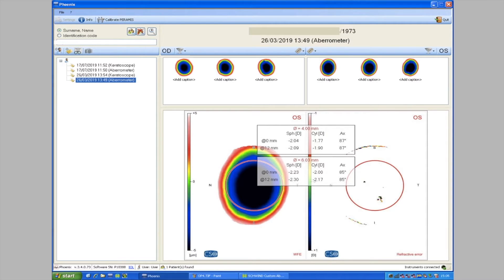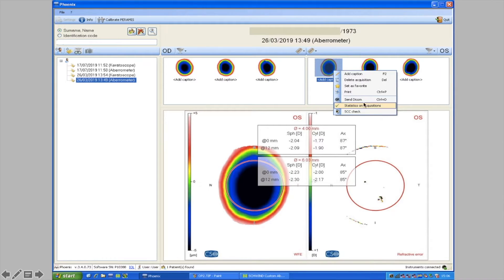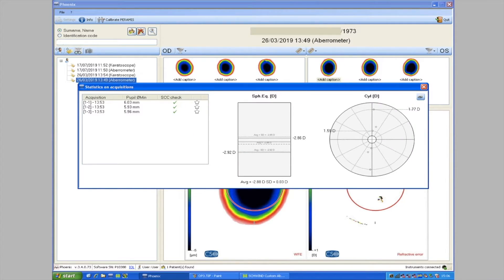Once we've acquired three scans we review them in the Phoenix software, which we've got open here. We're going to focus on the treatment of the left eye of someone in the presbyopic age group as an example. The first thing to do is right-click on one of these scans to get a dropdown dialog box, then click on 'Statistics on Acquisitions'. You'll then see this information drop out, which includes quality indicators for the scan.